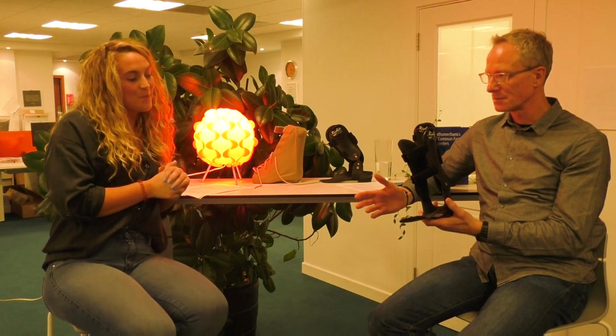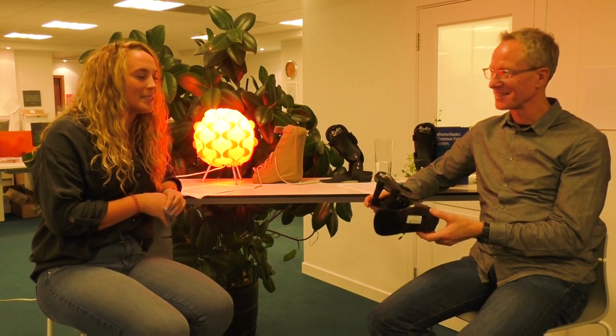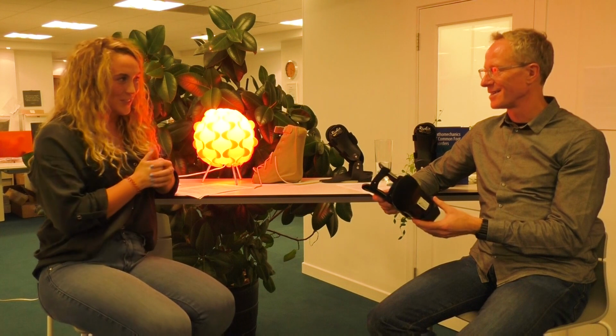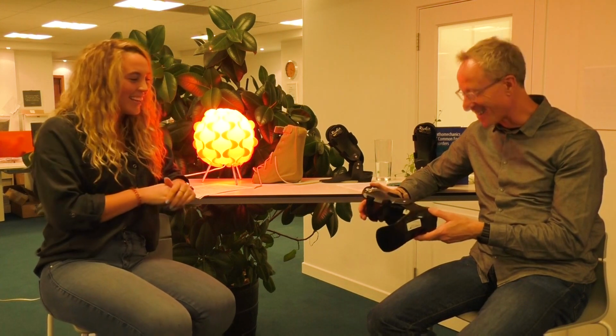So what's your understanding of a Kirby skive? What does it actually do? Well, from my understanding, I really hope I get it right. From my understanding, a Kirby skive brings the element of correction closer to the joint axis, the subtalar joint axis. So it seems that you're pushing closer to that imaginary subtalar joint axis. That's exactly what it does. So perfect. Well done, Sarah.